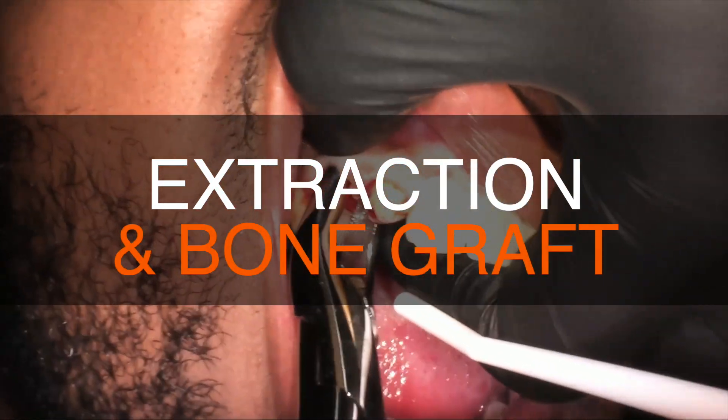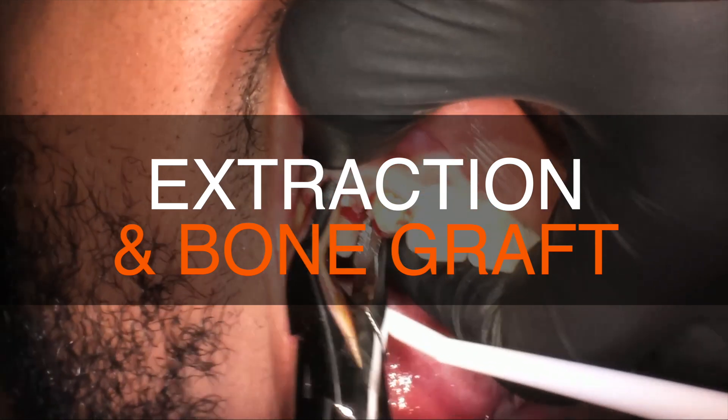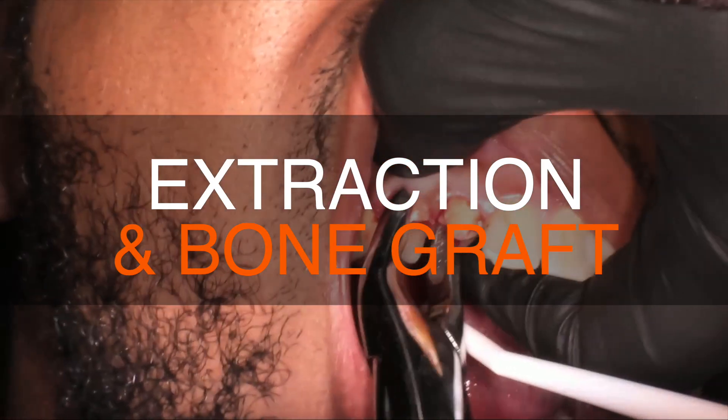This week we're going to do an extraction and a bone grafting, but it's not exactly simple. I struggle taking out canines — they're the hardest teeth to take out. As I've become more in tune to implant dentistry, I know how important it is to preserve that bone, especially the buccal plate, and that buccal plate is often so thin on our canines.